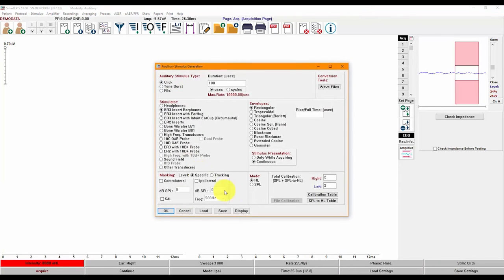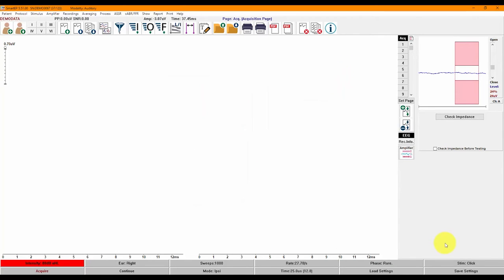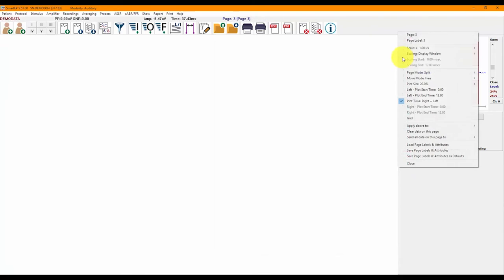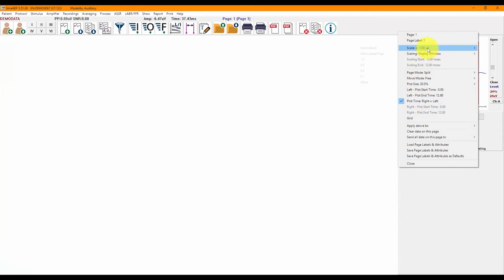A single click on Stim will open the Stimulus Generation Utility. The Amplifier button opens the Amplifier Settings window, where you can modify settings such as gain, high pass, low pass, and activate the line filter. The recordings will appear in the large white space. You can activate or hide a low-profile grid on the page by clicking on the Set Page button or on the Page Number. Clicking on each page, you will also be able to customize page attributes such as scale, page name, and more.